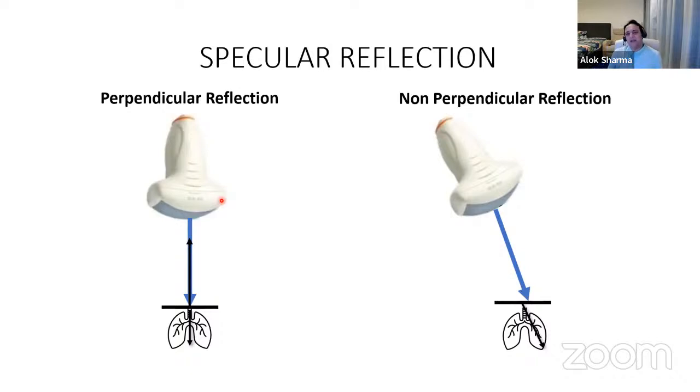Try and optimize that, especially when you're looking at the upper back in a baby who's prone, as I emphasized. The back tends to slope down. Again, when you go into the axilla, or in a baby who's supine, there's a sloping towards the axilla. What you might want to do to get that straight is put a small towel underneath, to make that area a little more horizontal so you're able to get better contact.